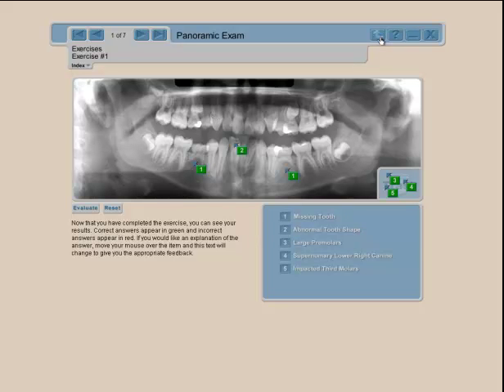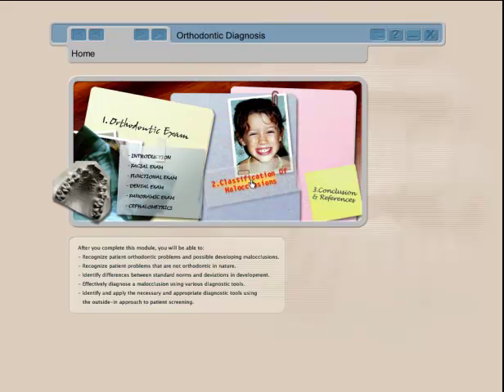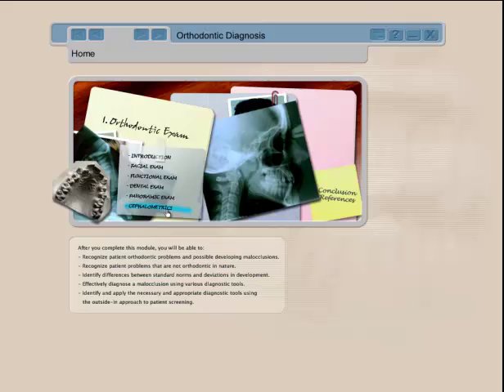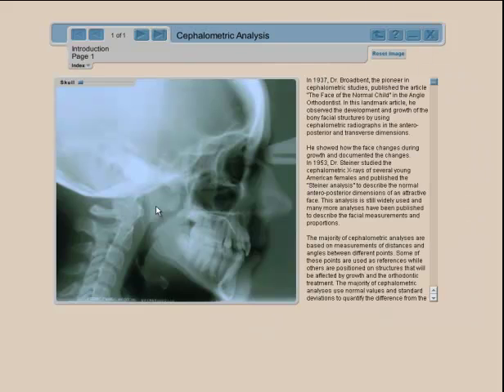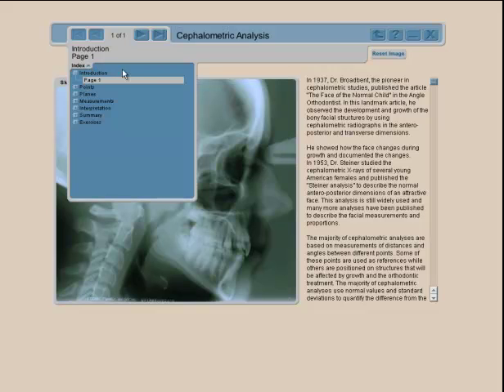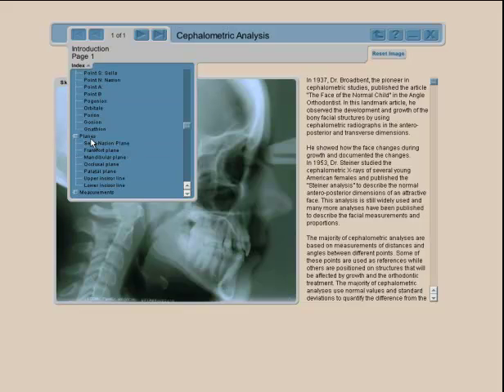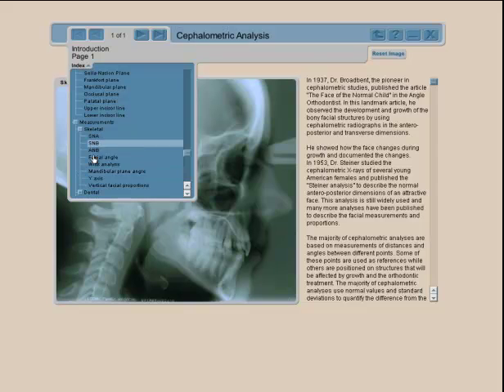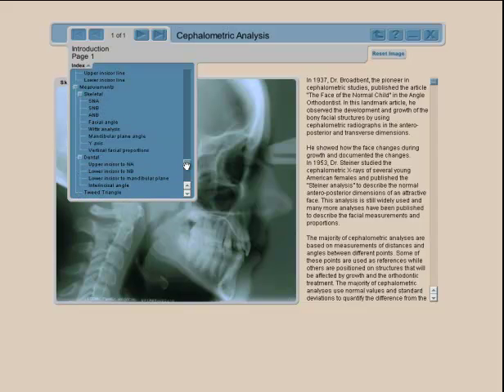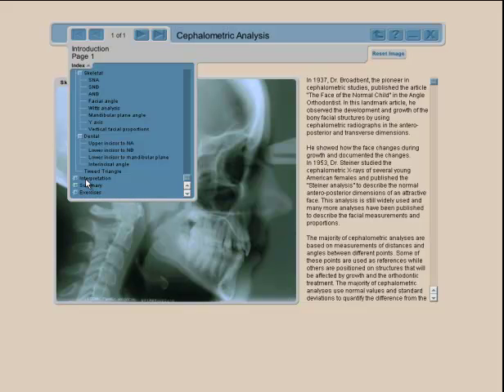The last section is cephalometrics — you can refer to other videos for a full walkthrough. You have points to learn, though these are not all cephalometric points — just an introduction. Once points are determined, you have planes, then measurements both skeletal and dental.